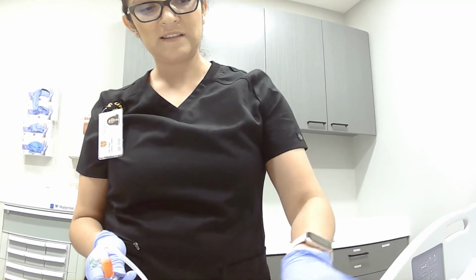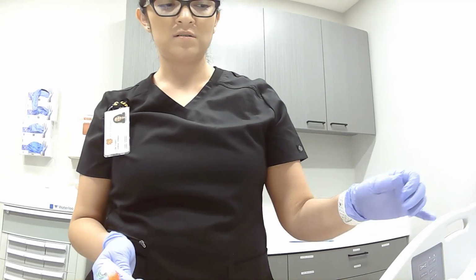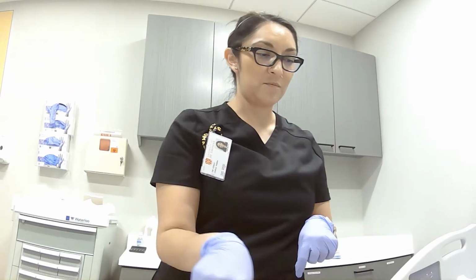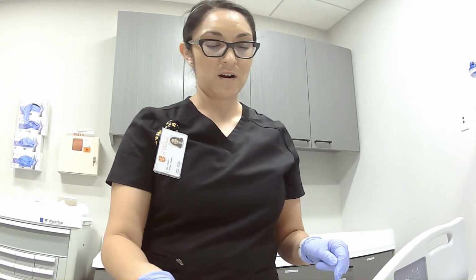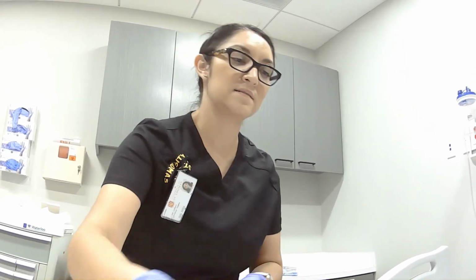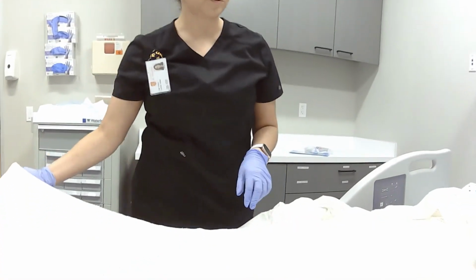And so we'll clean the patient if we need to again, and then we've thrown all this away. We'll put her back in bed. I'll change my gloves. We'll put her gown back down, bed covers back, so that way she's nice and comfortable.